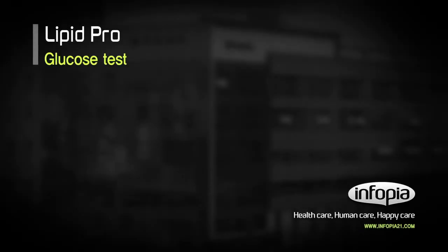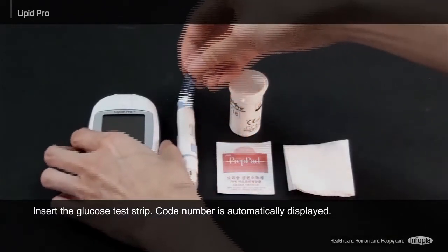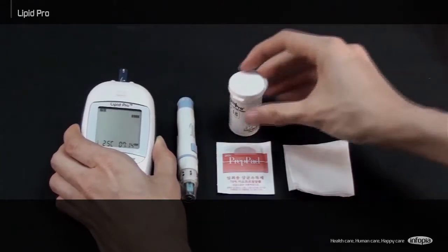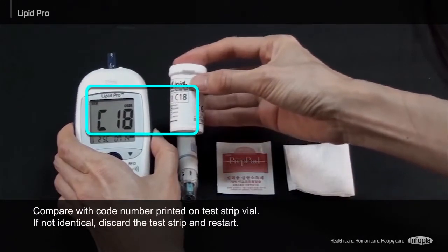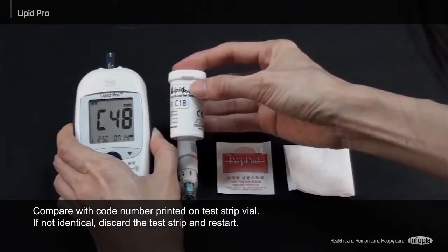Glucose Test. Insert the glucose test strip. The code number is automatically displayed. Compare it with the code number printed on the test strip file. If not identical, discard the test strip and restart.